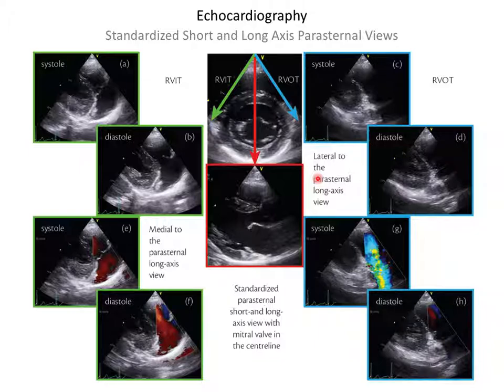So basically, as you can see, good echocardiography is really dependent on a skilled operator. The person has to have good hands, understand cardiac anatomy, and have a steady, smooth ability to seek things out with an echo transducer. And watching a good echo tech work is great. I mean, they're very, very good at it, the experienced ones.